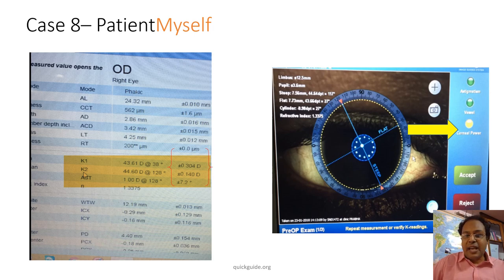So he had the Pentacam, and I wanted to do the Pentacam and see, is it because of dry eyes, is it because of the cornea? But before I did, I checked the data in the Lenstar, and I just wanted to see what is it over here. And if you see in the Lenstar, the axis standard deviation here is 7.2 degrees, which is more than double what is acceptable. As I said, the standard deviation of the axis should always be less than 3.5 degrees.